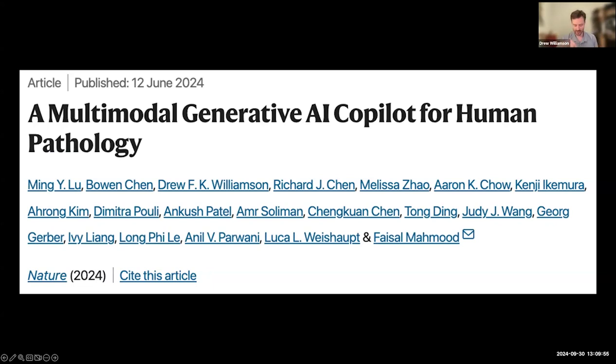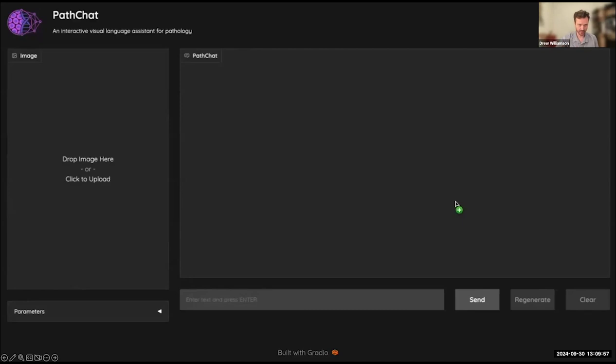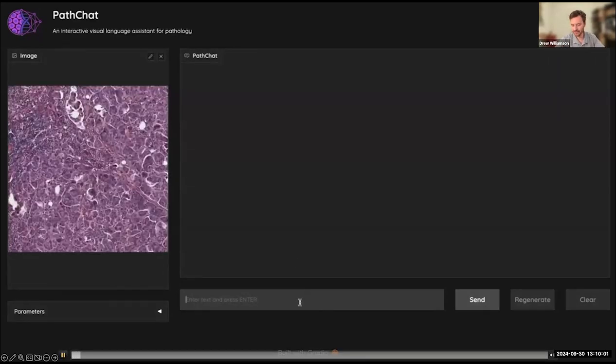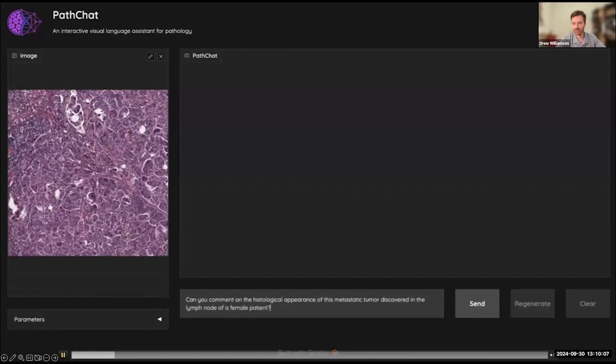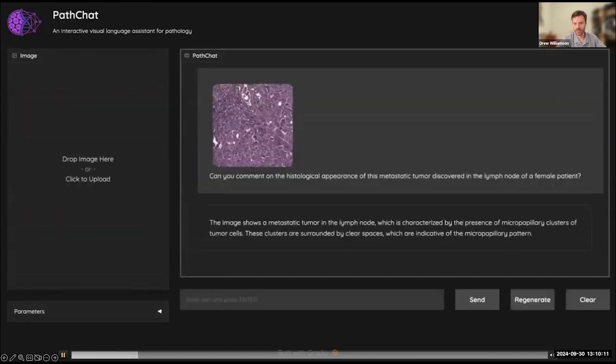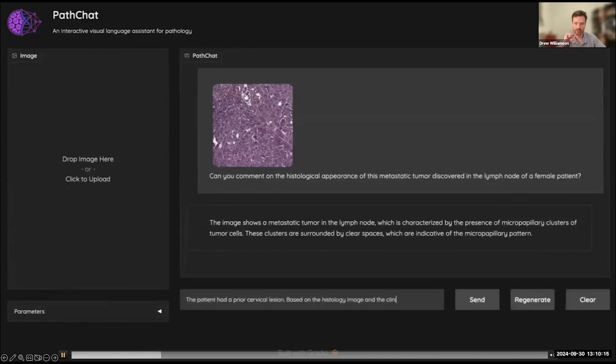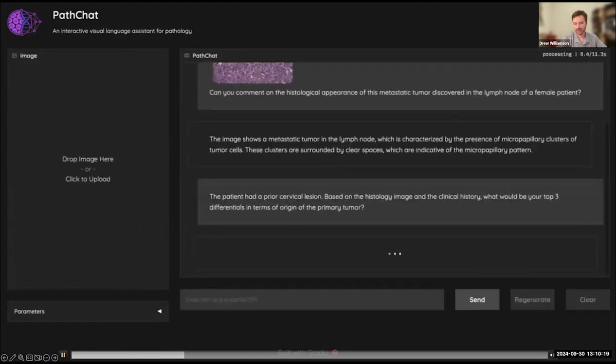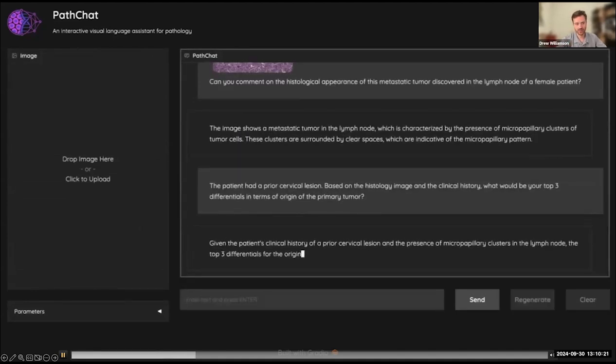As a little video demo of what we built, we trained an AI model using a couple of different techniques, added a bunch of pre-trained models, collected data, and did some evaluation, all to essentially make a version of ChatGPT or some other generative multimodal model that a pathologist could interact with using text and images and get the model to talk to you about it.